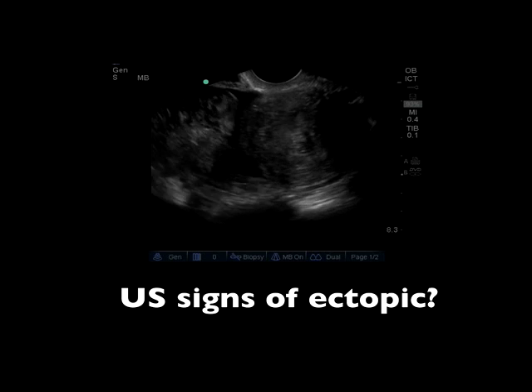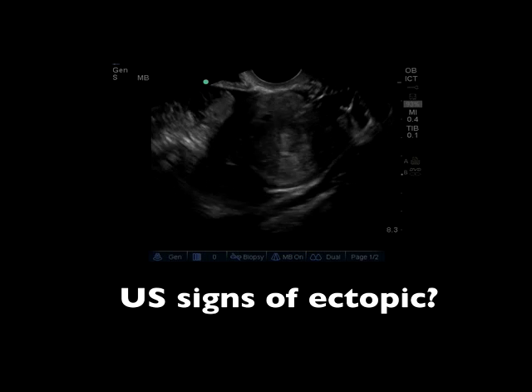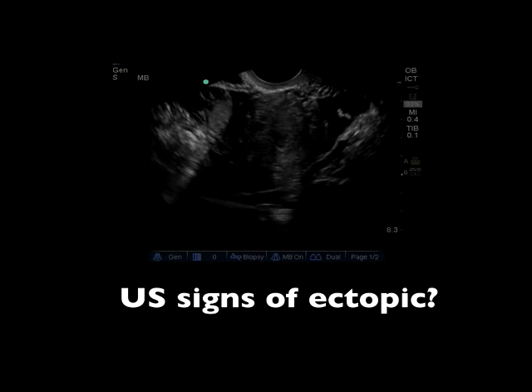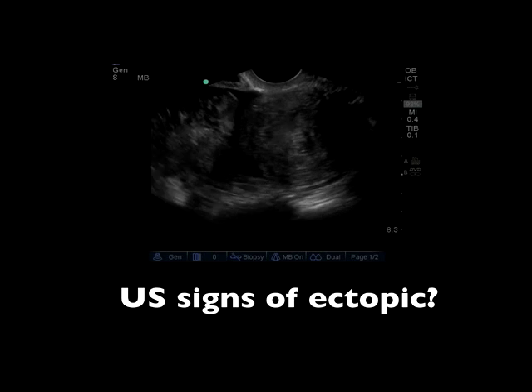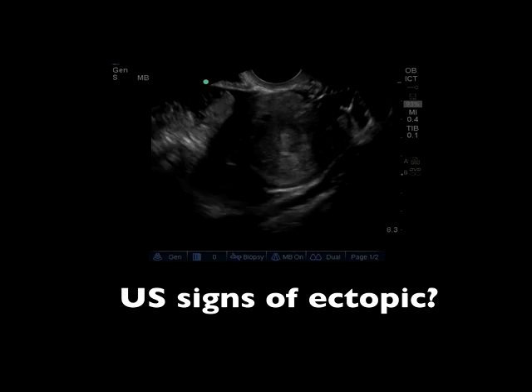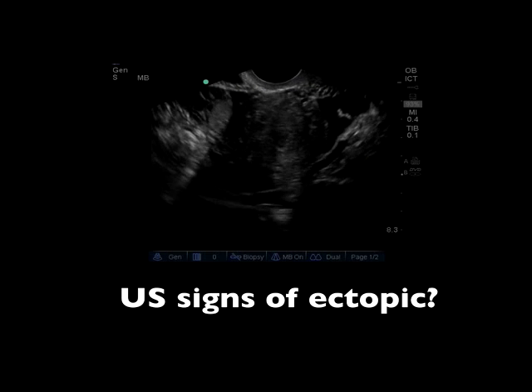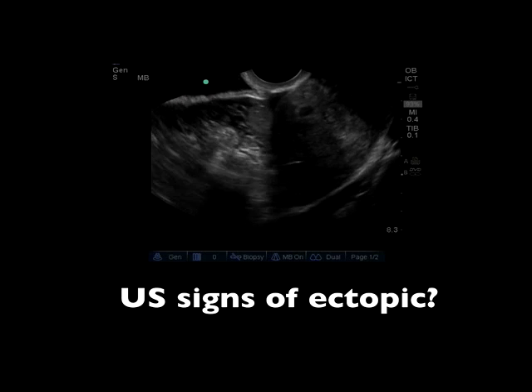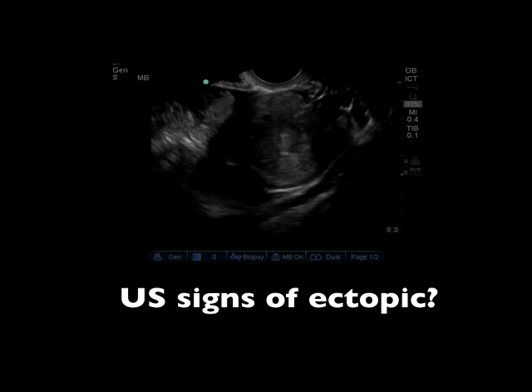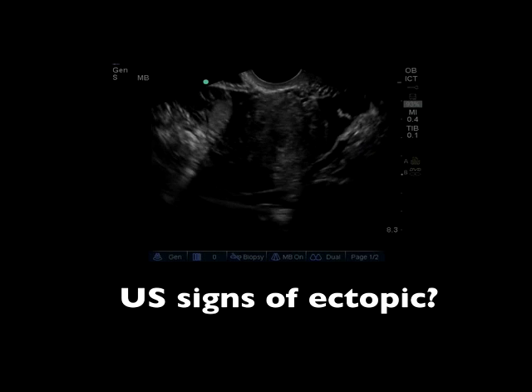Some of the ultrasound signs of ectopic pregnancy would be evidence of free fluid or adnexal masses. This is a transvaginal scan — we can see the bladder on the far left of the screen right where the probe marker is, making this a sagittal image. We can also see some free fluid surrounding the uterus, and fanning from right to left they're also able to visualize an enlarged adnexa.